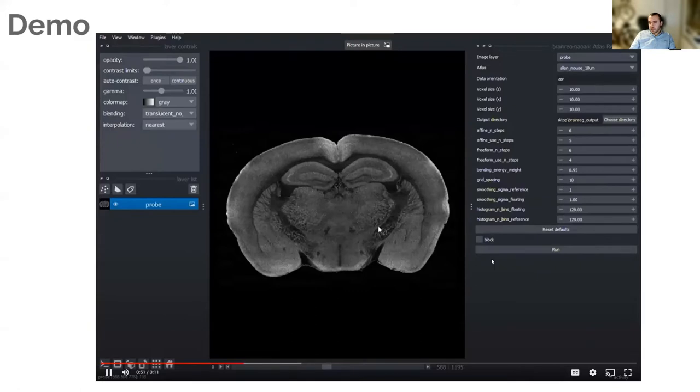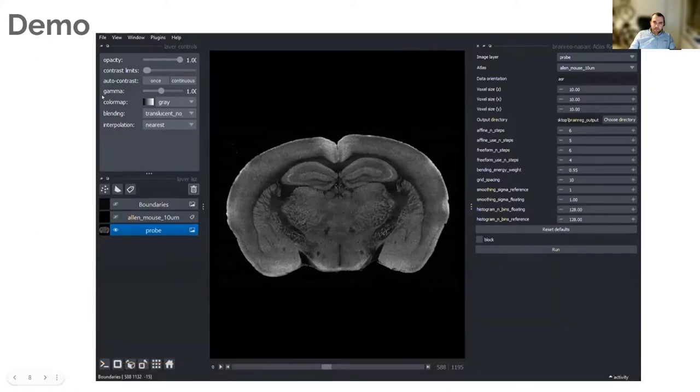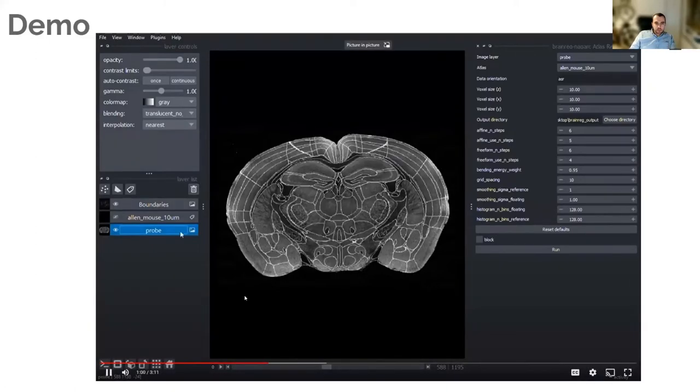Press the run button. The registration can take either 30 seconds in some cases on very low resolution data, or up to about 40 minutes if you're doing it on very high resolution data with a high resolution atlas. But in this video, it magically pops up.